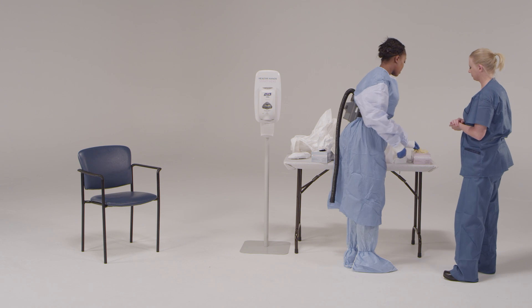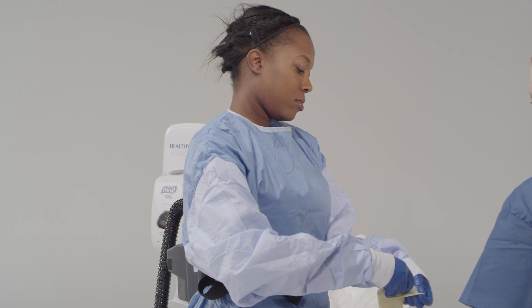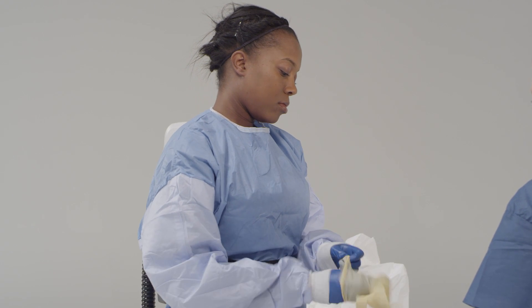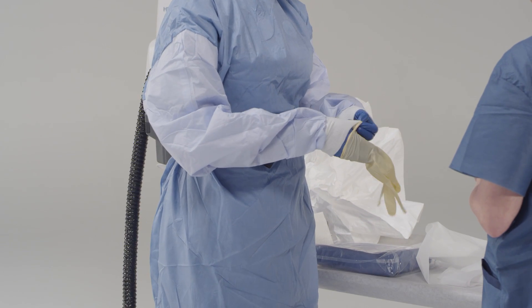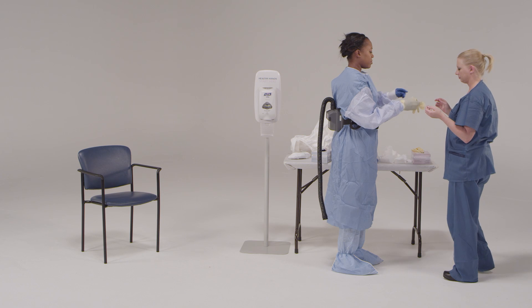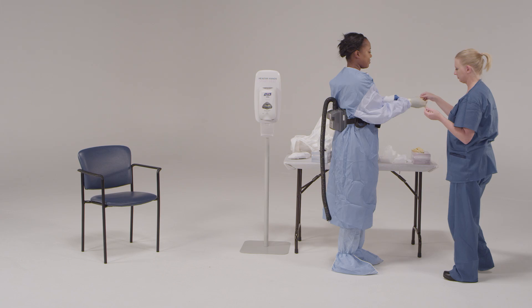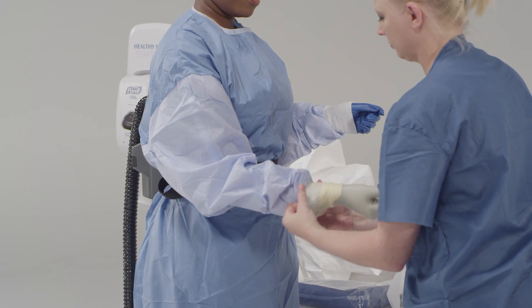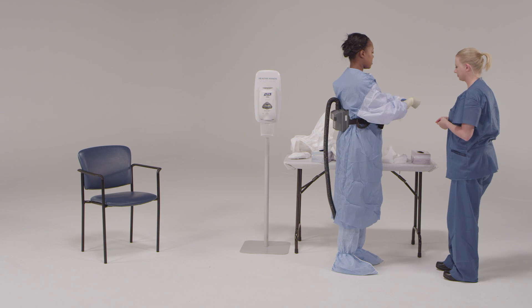Put on the second pair of gloves with extended cuffs. Some facilities may choose to use outer gloves of a different color to easily identify rips or tears. Ensure the cuffs are pulled up and over the sleeves of the gown. It may be necessary to ask the trained observer for assistance when putting on the outer gloves. Double gloving provides an extra layer of safety during direct patient care and during the personal protective equipment removal process.